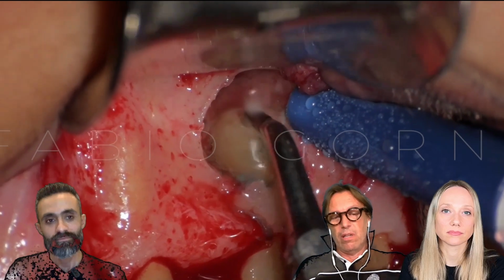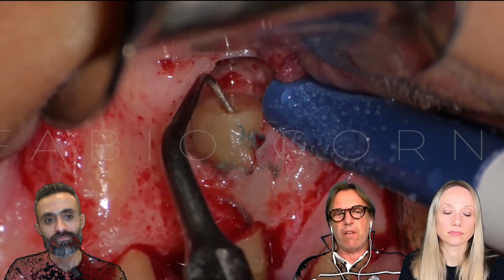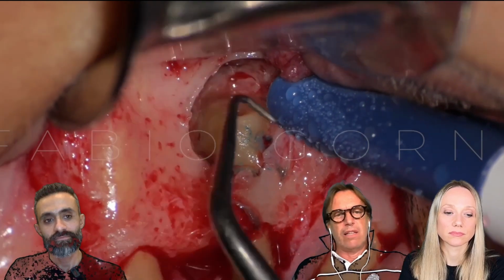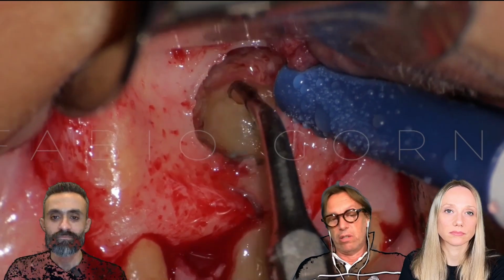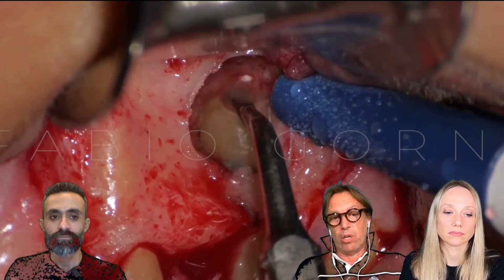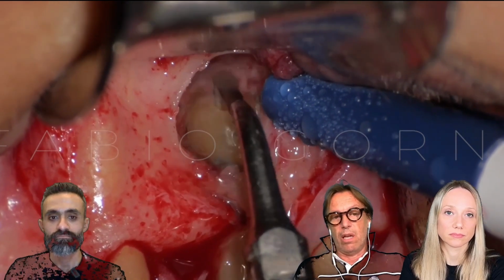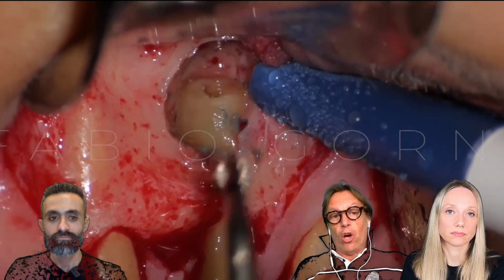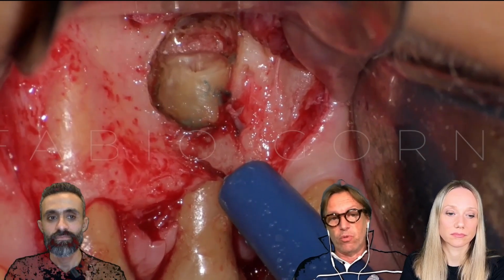So the bevel is important. Maybe 45 degrees doesn't change anything in terms of success rates, but it changes a lot during your surgery, because you can see the anatomy directly, and you don't need to use, for example, a micro mirror to check everything.